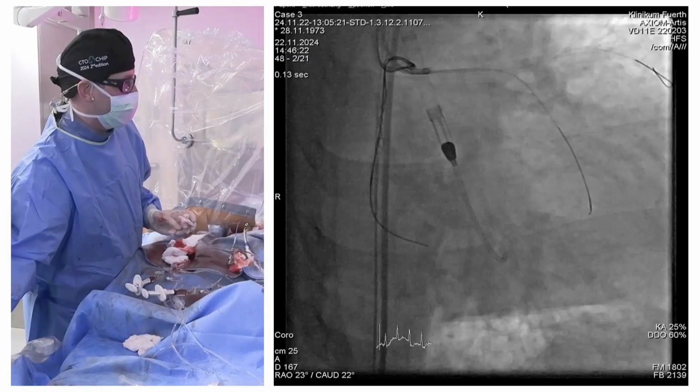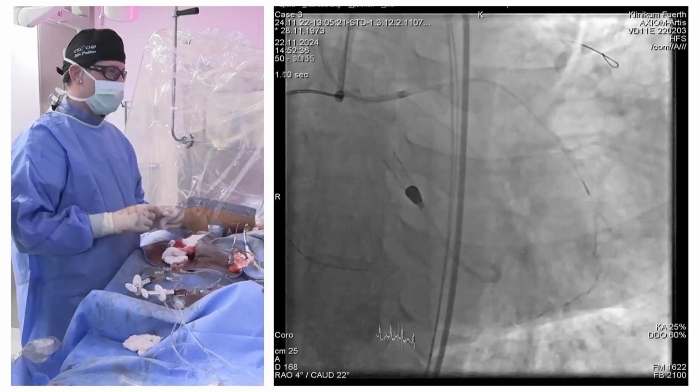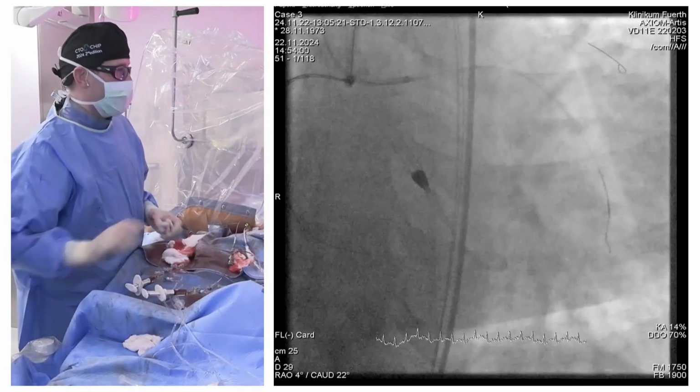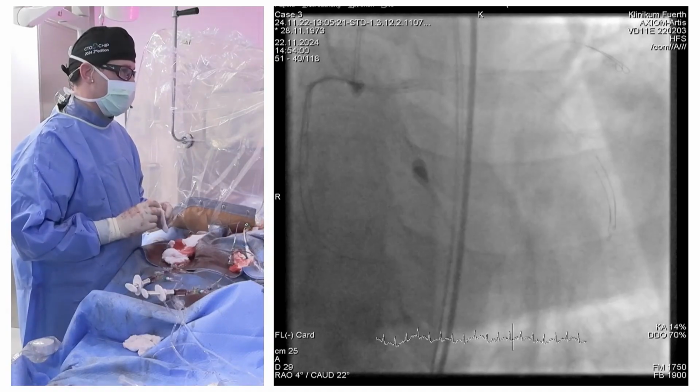And then we did the tip injection later on because the wire didn't want to go. You see that nice kink there, which is like an S curve. And then we knew more or less where to go.